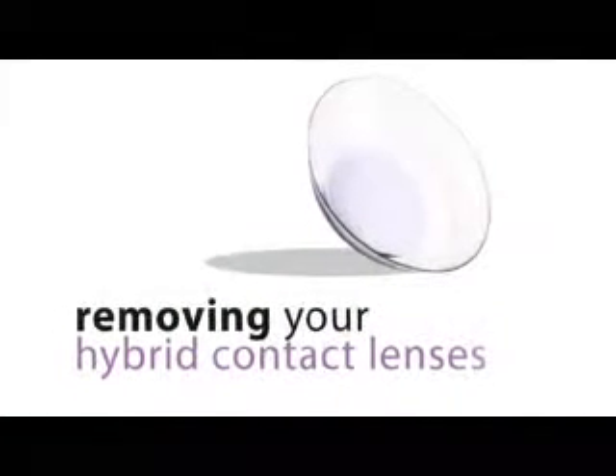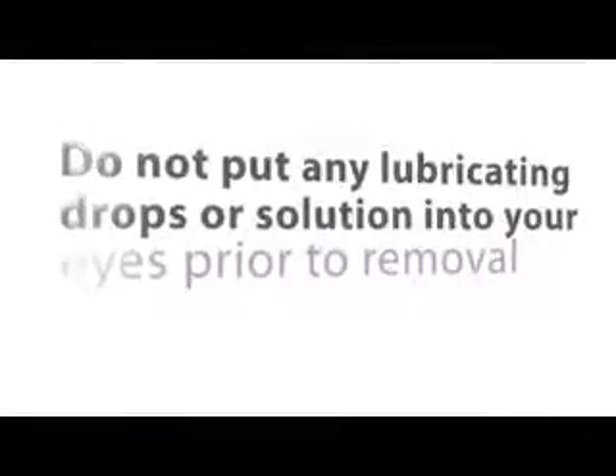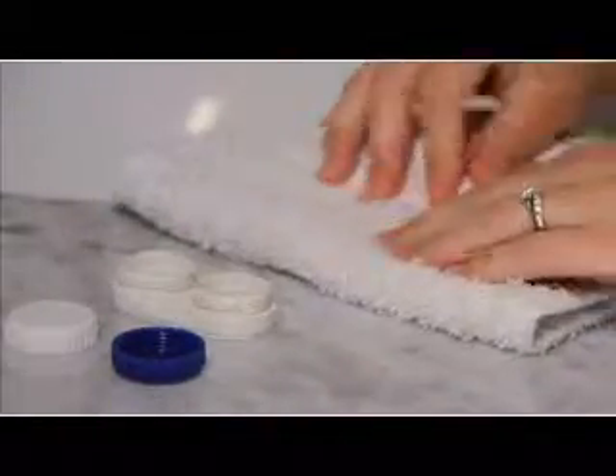Now let's take a few minutes to review how to remove your hybrid contact lenses. Before you remove your lenses, thoroughly wash your hands with a mild, lanolin-free soap and then dry them with a clean, lint-free towel. Do not put any lubricating drops or solution into your eyes prior to removal. It's important to be sure your hands are completely dry before attempting to remove your lenses — this will optimize the gripping effect of the fingers on the edge of the lens. If the lens or your fingers are wet when attempting to remove your hybrid lenses, it can make it difficult to grasp the lens effectively. If your fingers become wet from removing the first lens, be sure to completely dry them again before removing the other lens.